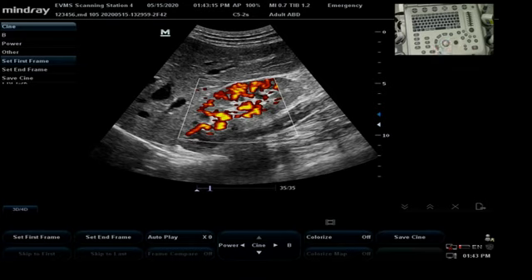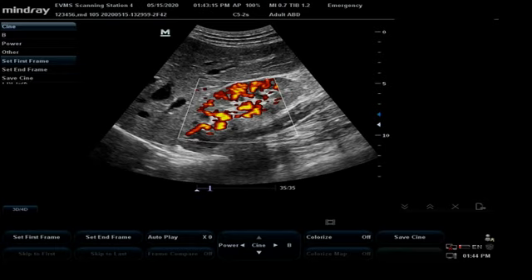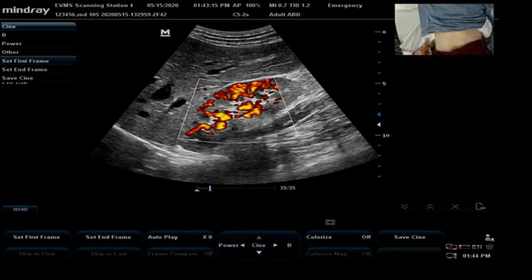Now I'm going to move to the left kidney, and to save myself the reach, I'm going to ask my patient to roll up towards me. Oh, wait. Thank you. Sorry. Okay, roll up towards me. Thank you. And I am going to put some gel right on this natural waist. If you try this position, which I strongly encourage, I encourage that you have your patient take their left arm and stretch it out, make their waist nice and long.